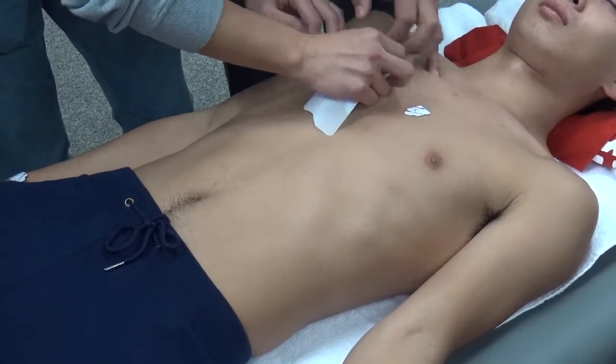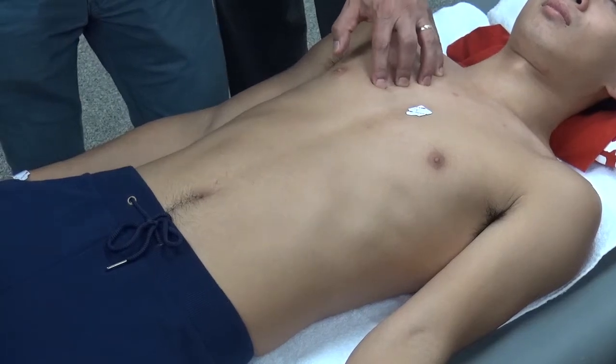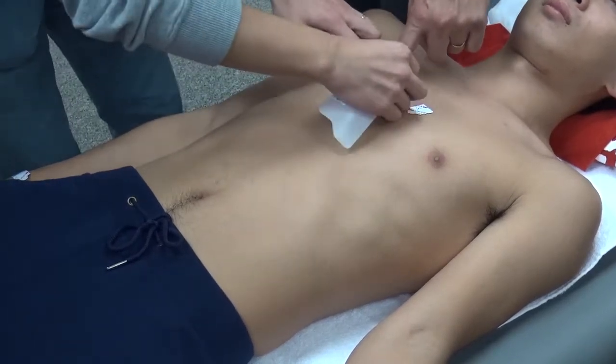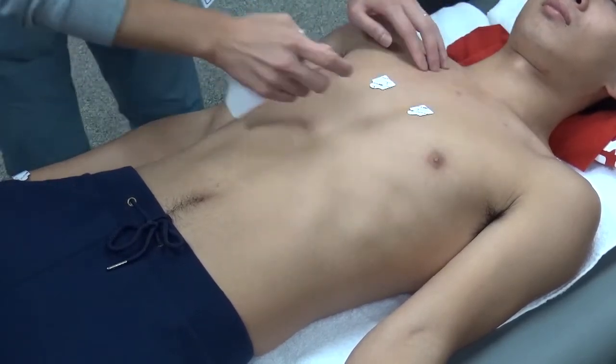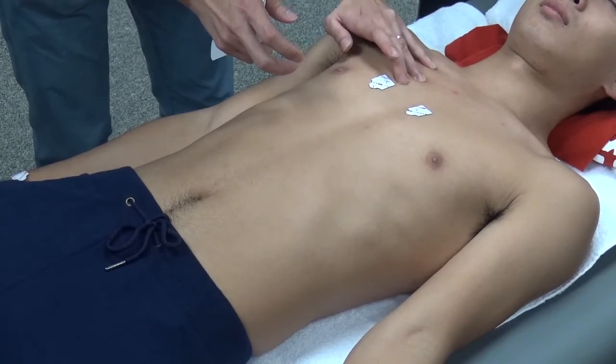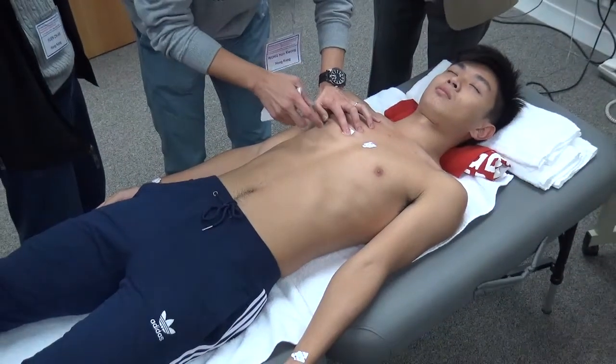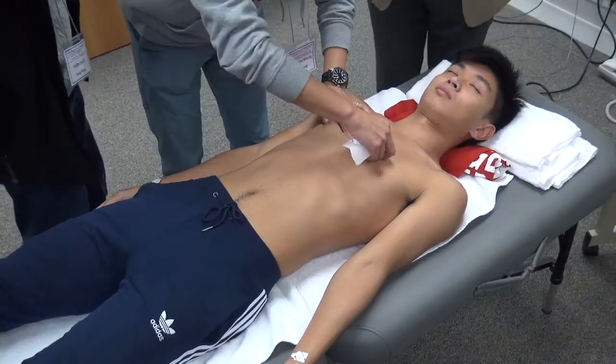Right, I'm going here. 1, 2, on the rib there, roll 3, with the 4th is actually there. Just try your fingers again. It's really important. Put it on and roll your finger onto the next space. The ribs are wider than you think, and it's lower than you think. There we are. Now you can feel it, yeah? It's really important. People often go too high.